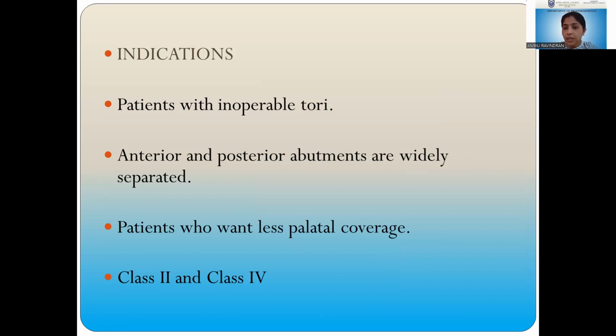It is used in Class 2 and Class 4 situations. For patients who complain about large coverage of the palatal region, this kind of major connector can be given. And if the anterior and posterior abutments are widely separated, we can give this.